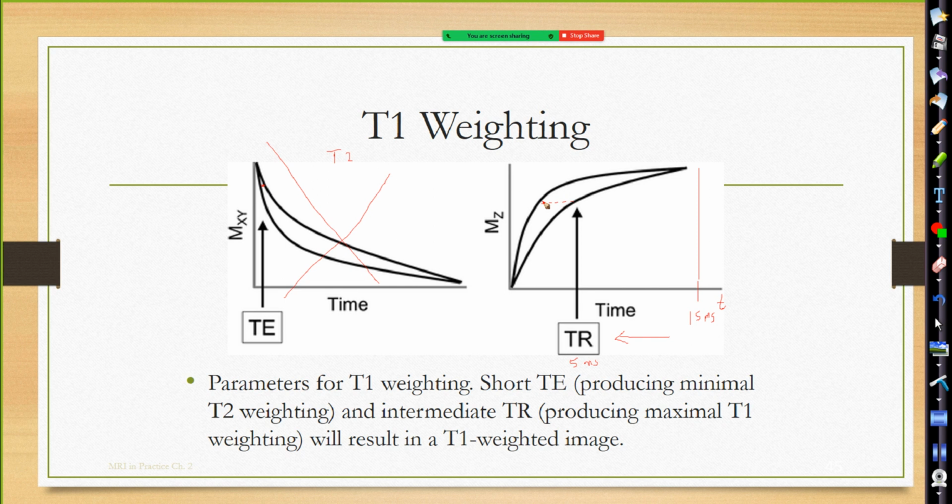Okay, but we have ranges in clinic, and you'll see, never go outside of 300 to 700 for a T1. Never go outside of, for a T2, 3,000 to, you'll see your TR ranges for certain scanners. Okay. Because, yeah, you are trying to highlight fat, but you also want to highlight other structures. So you don't do it at, like, 100. You kind of have a range. But, yeah, that's a good question. But it really is just the physicists researching what these relaxation rates are at various field strengths. And that's all programmed into the computer already.